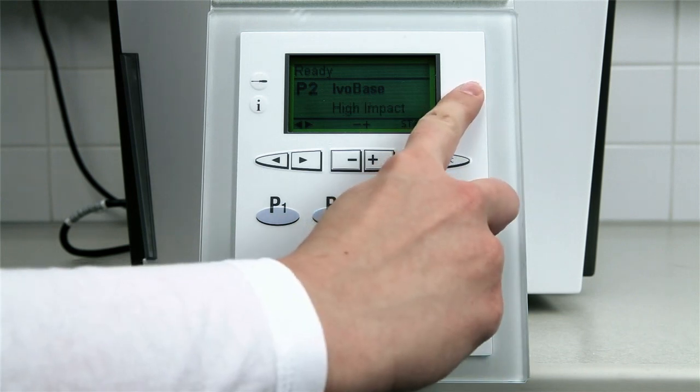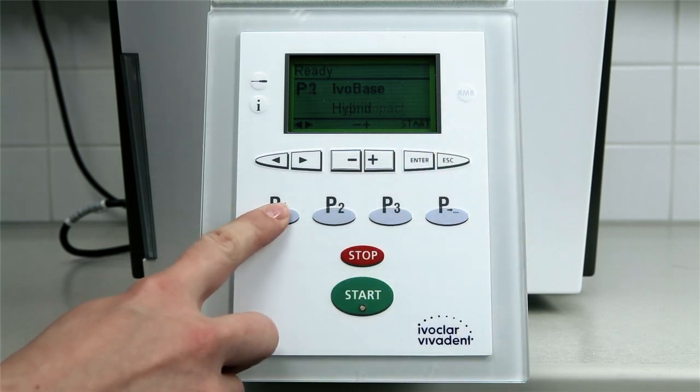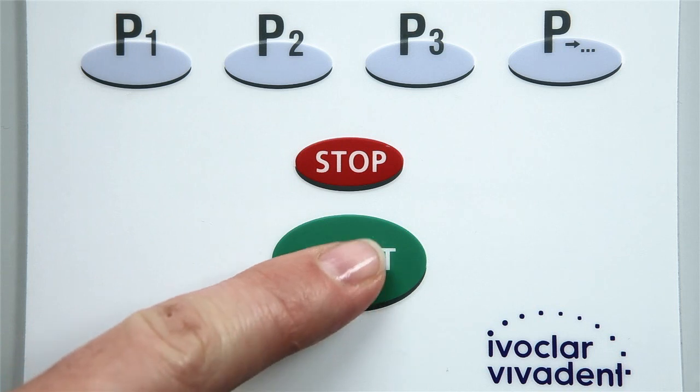To further reduce the residual monomer content, the optional RMR key can be activated. Select the corresponding program and start the program.